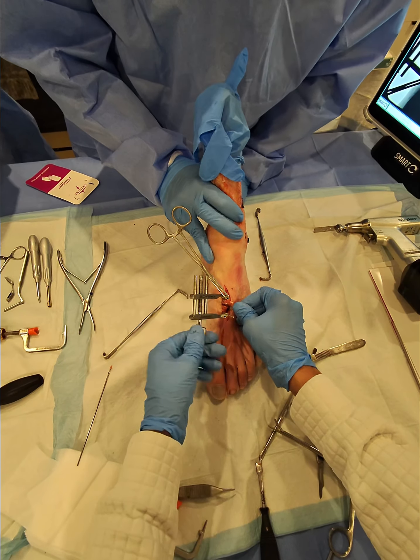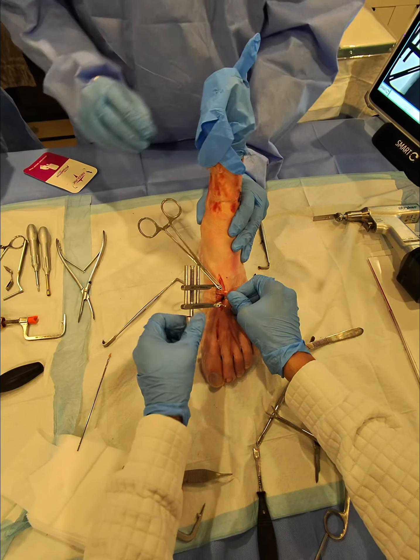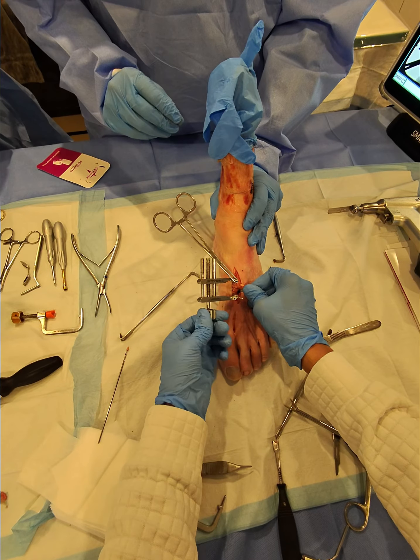So we're just going to go here. Now you're going to tighten down to two finger tightness. We don't want to over tighten here. We just want to appose.